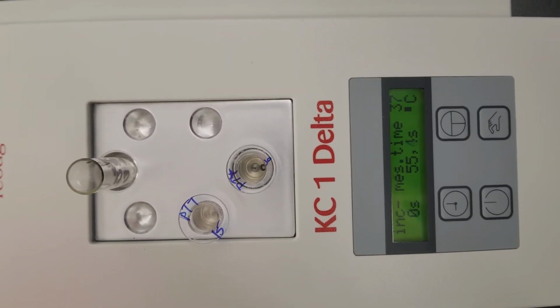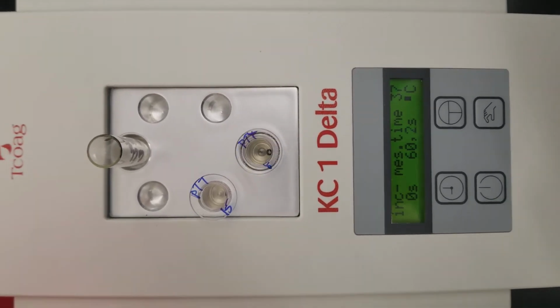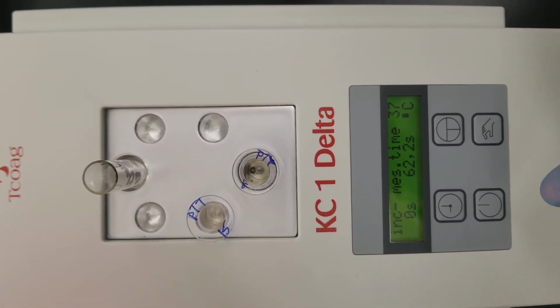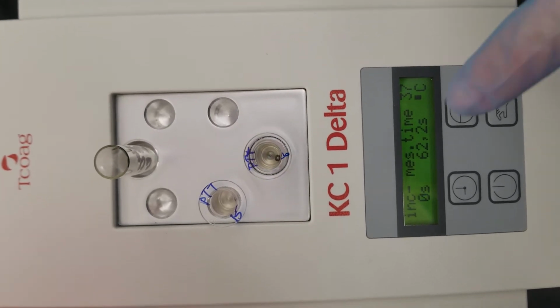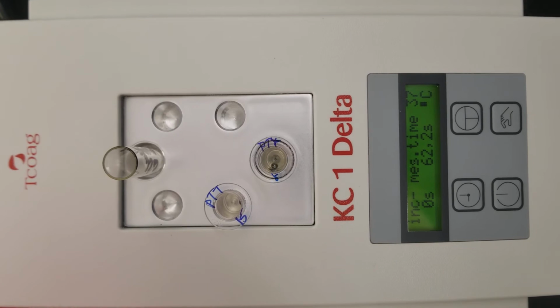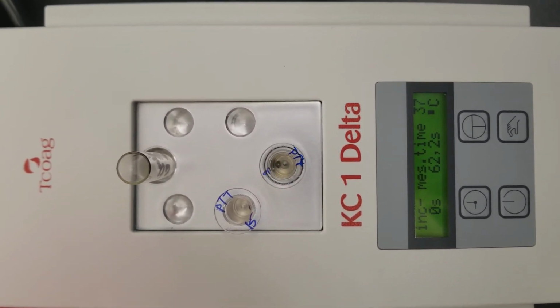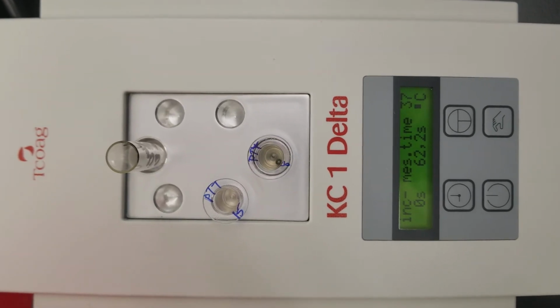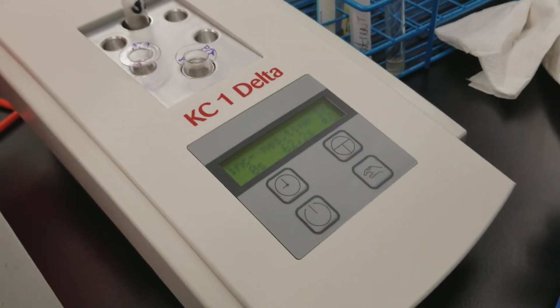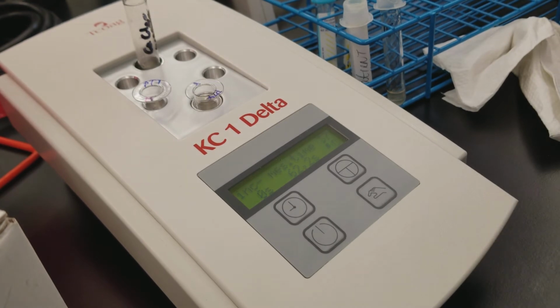All right, so I know that I did that last part fast. So when it says the time is exceeded, you want to hit that clock face. Oh, there we go. We got to 62.2. So it's not really staying completely still. See, it's moving around, but the analyzer says that it's already stuck. So there we go. Isn't that fun? It's kind of like a little ride. All right. So I know that I did that really fast, and I said the wrong thing when I did it, but I just wanted you to see the ball and everything.